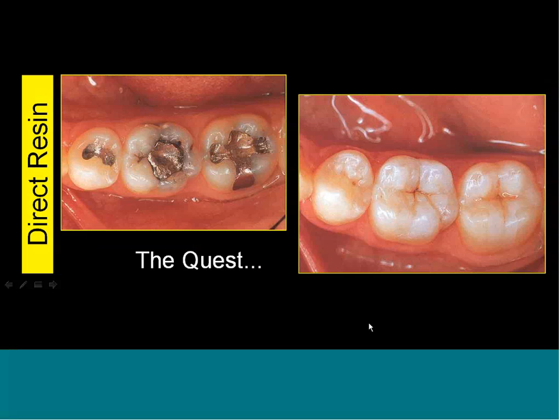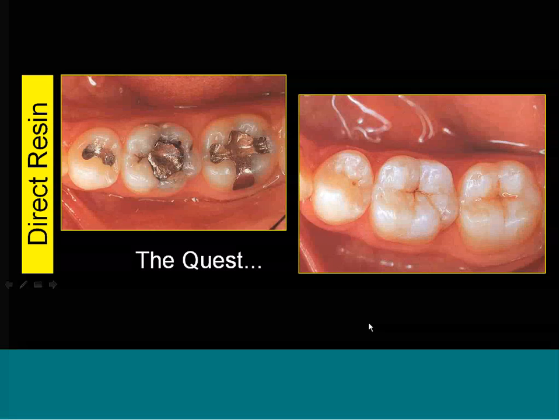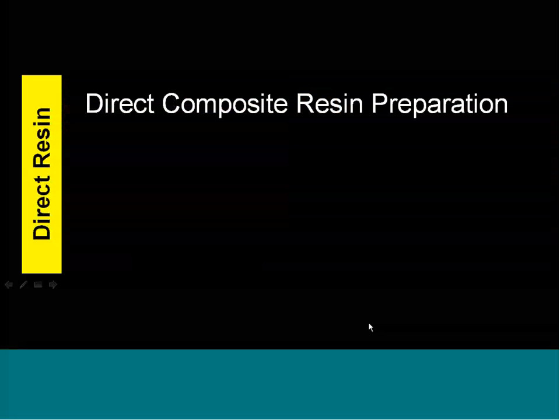So the quest is to take something that's very unnatural, amalgam, it's ugly, it does nasty things to teeth, and transform those teeth into something that's very aesthetic, much stronger, makes the patients happy, gives the doctor some personal satisfaction as well. So let's talk about direct composite restorations.